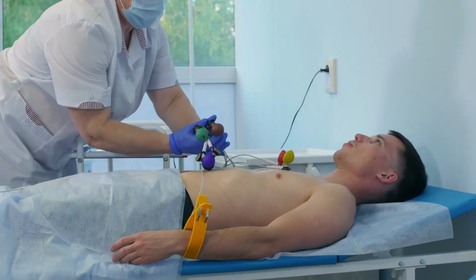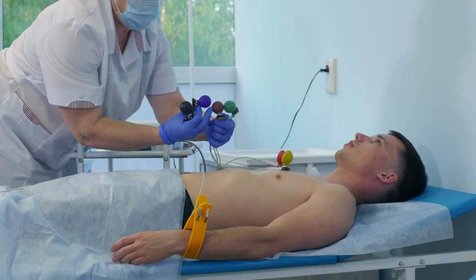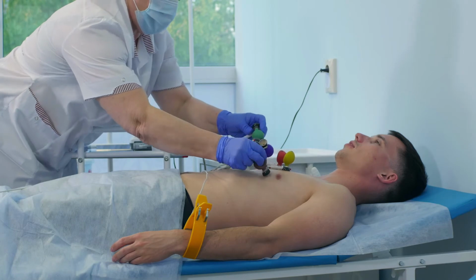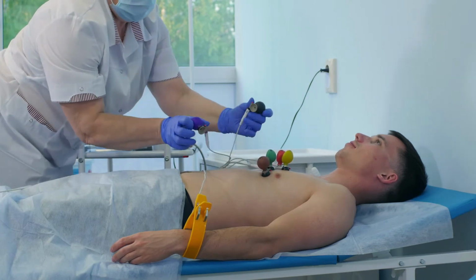Changes in the normal ECG pattern occur in numerous cardiac abnormalities, such as inadequate blood flow around the heart or electrolyte disturbances. Electrodes are placed on the patient's limbs and on the surface of the chest. The overall magnitude of the heart's electrical potential is then measured from 12 different angles, which are called leads. This is recorded over a period of time, usually around 10 seconds.